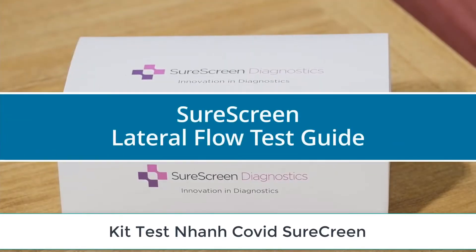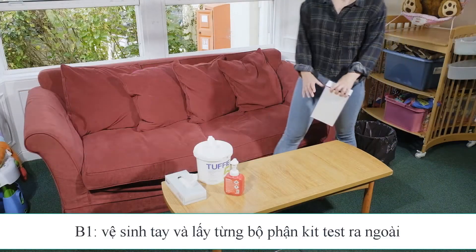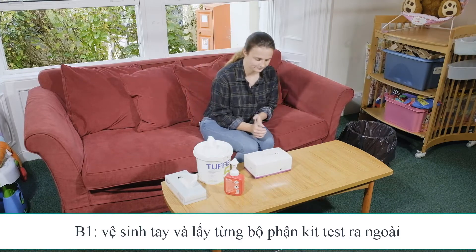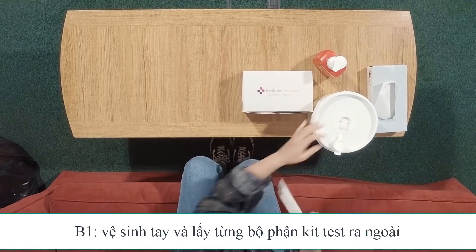As we continue to live with COVID-19, part of our surveillance testing program will be the introduction of lateral flow tests. This will be a self-test which you will do twice weekly at home. If you can, you should do this test in the morning. Allow just over 10 minutes to complete your test.